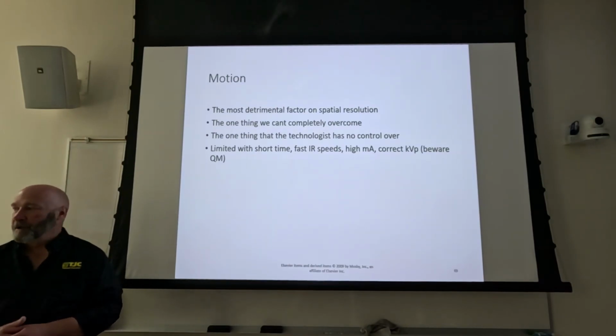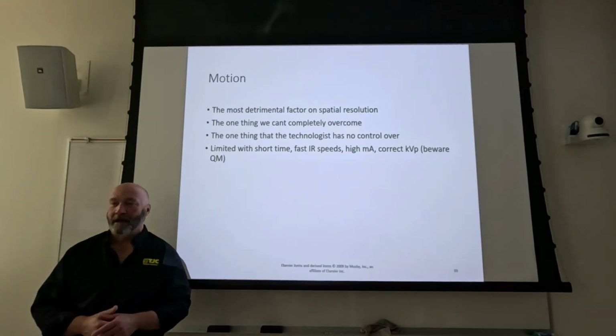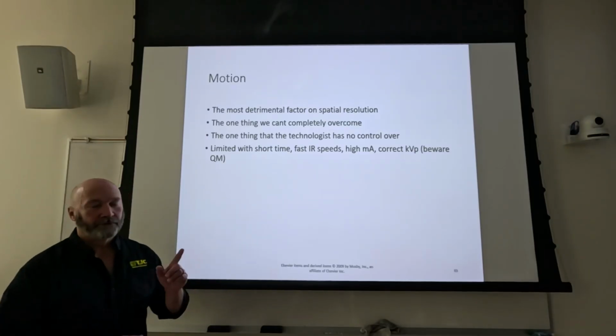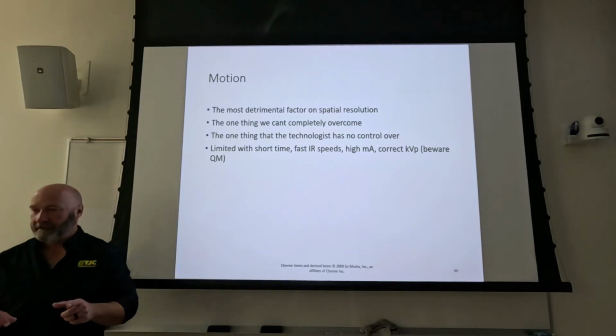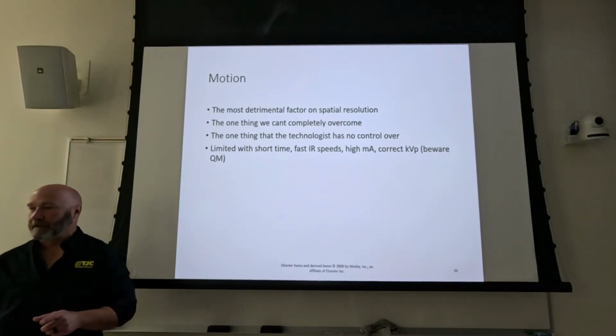What about portables? What kind of timers do portables use? Making y'all dig deep today. A lot of blank stares. It's what we refer to as a mAs timer. So portables, when you set your technique, have a set mA station, 100 mA.